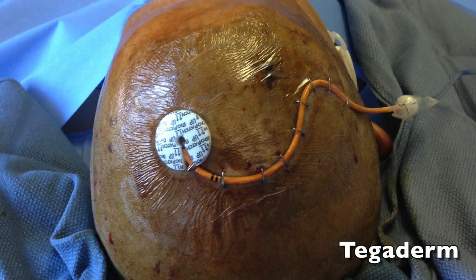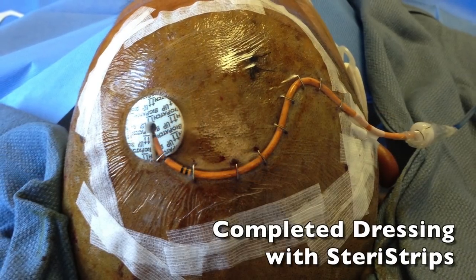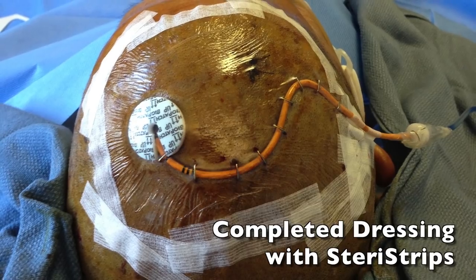A clear tegiderm dressing is then placed over the site. Finally, the edges of the tegiderm and distal catheter are secured with steristrips.